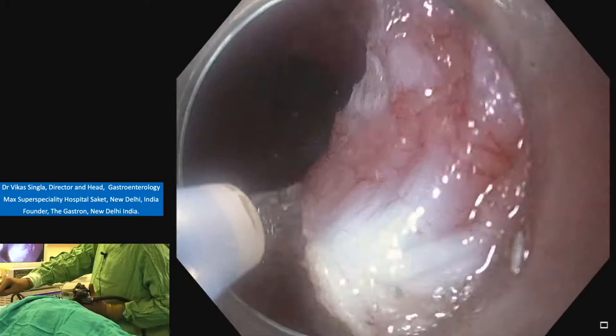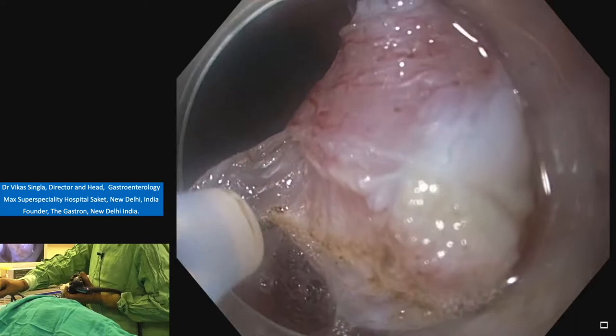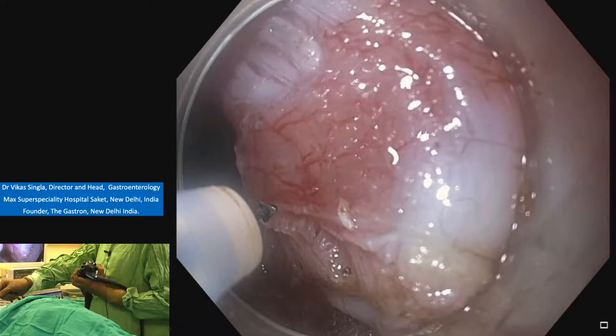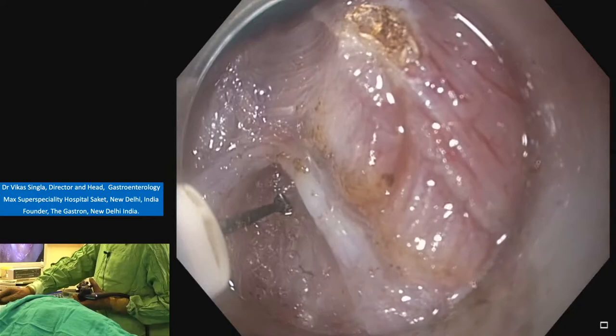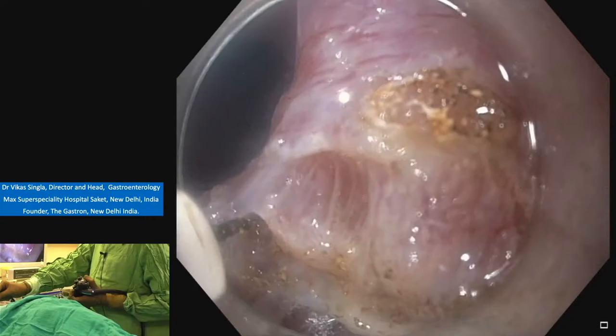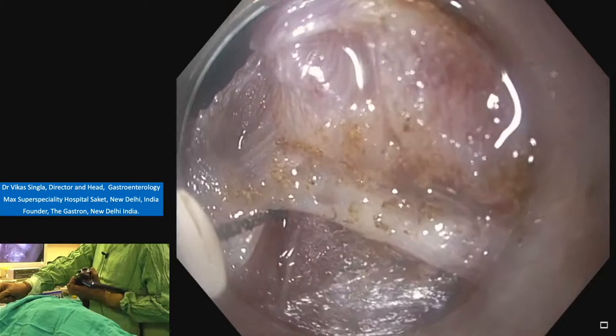Again, below it. So one trick here I want to explain. Some wounds there, we'll apply the current with the tip. So our knife should be minimally outside the cap. You can see the knife is very close to the cap. So that gives a better control. Again, coagulation and then cutting. Knife out. Coagulation and then cutting.